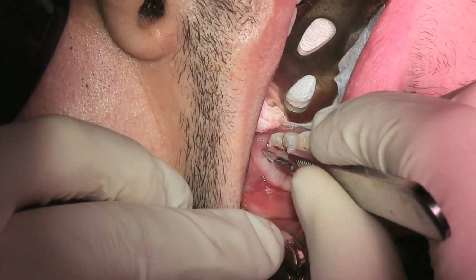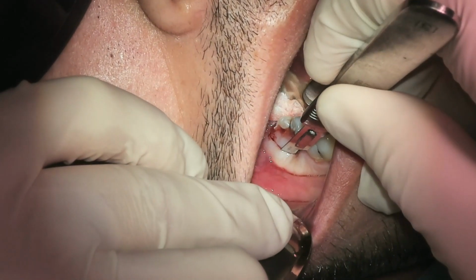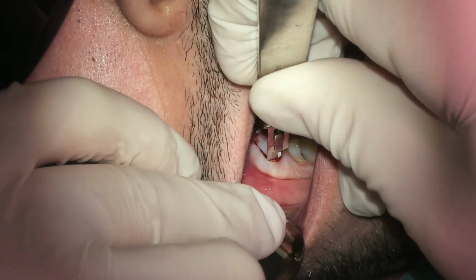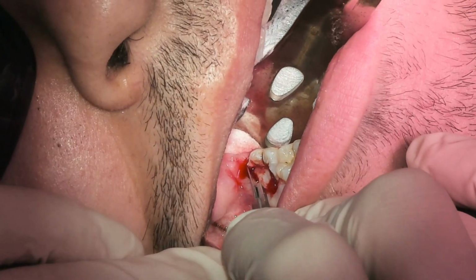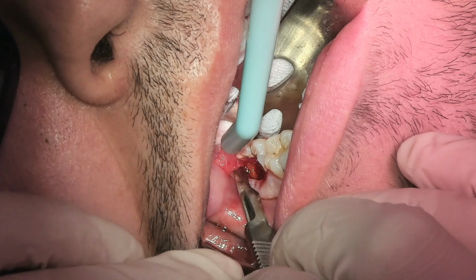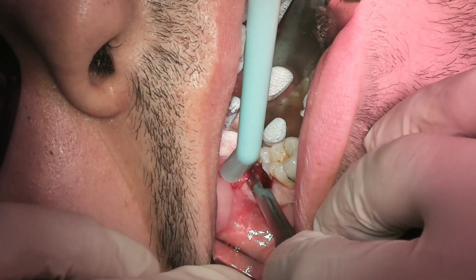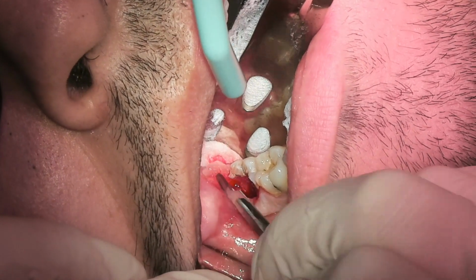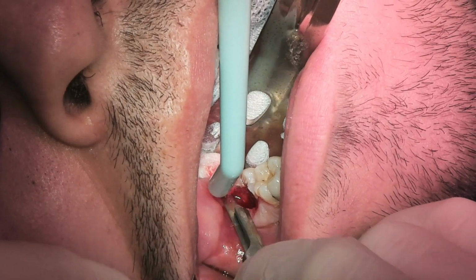And as you can see, the gingival overgrowth here is quite a lot. So for me personally, if I cannot see what I'm doing, I need to make sure I can see what I'm doing. So here we are removing the gingival overgrowth, and I wanted to make sure that I can fully see everything that's going on before we get started. So this is the excess gingiva being removed, and here it goes.